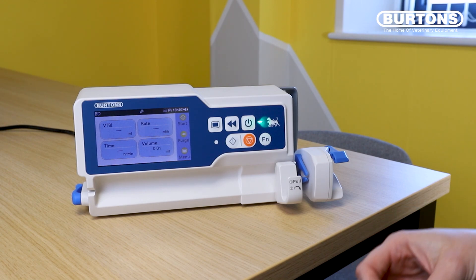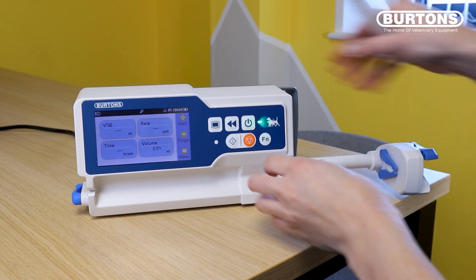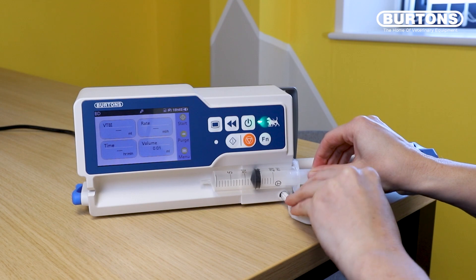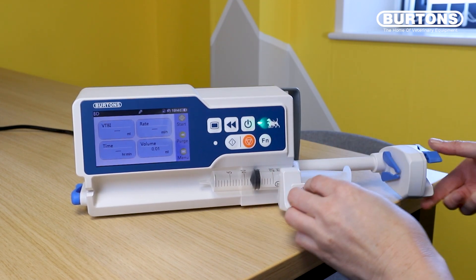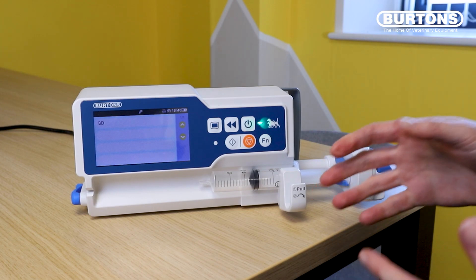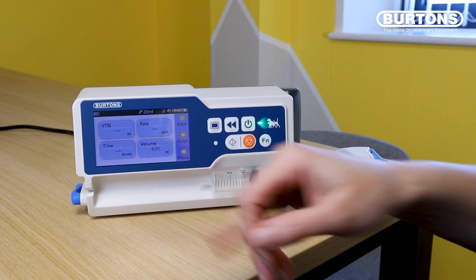You can load your syringe straight away just by extending the driver, opening up the switch and then loading the syringe. It will then ask you to confirm what type of syringe that you've placed into the driver. In this instance I'll hit BD syringe.